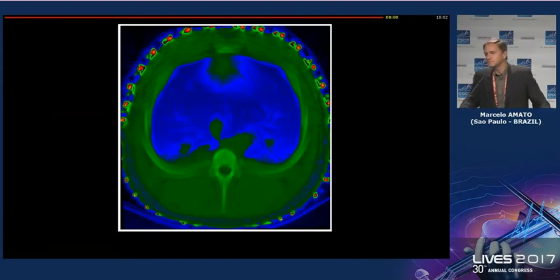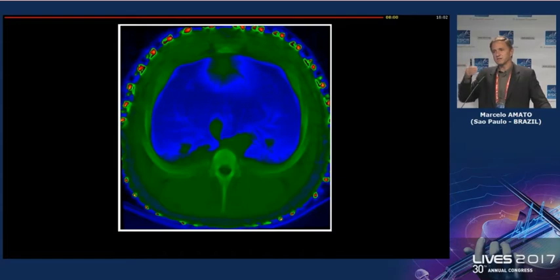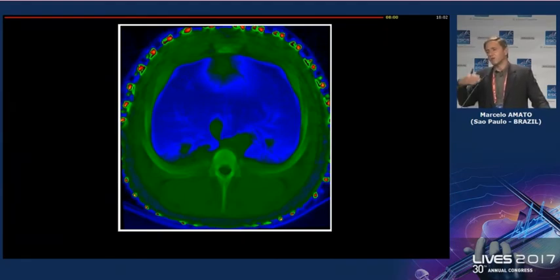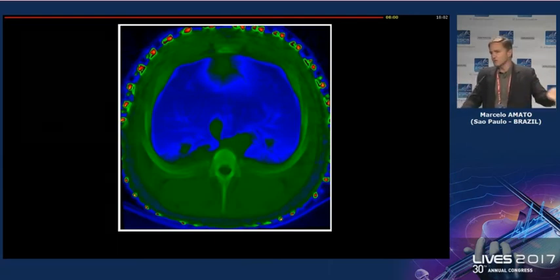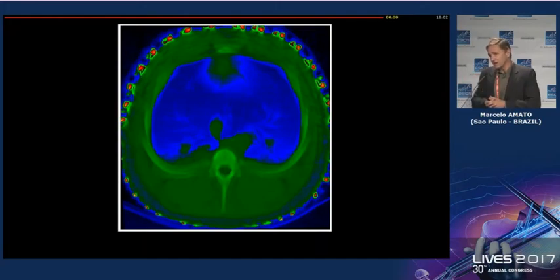You're using it clinically. Do you see a lot of side effects? Hypertonic saline, we are injecting 10 mLs. In fact, we are decreasing this amount to 5 mLs of 10 or 20% sodium. When you give hypertonic saline, let's say for brain injury, the total amount is, let's say, 100 times more. The only problem is that it's very fast.